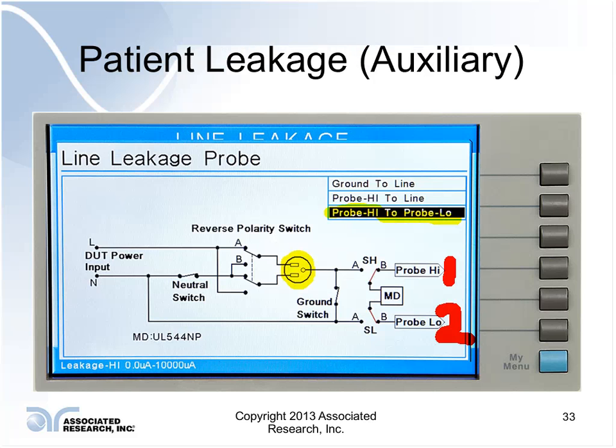back to probe low. Think about this as pretty much, I mean, anybody out there who's used a standard voltmeter or LCR meter or current meter or something like that, you're just using 2 probing points. It's almost the same thing. You just picture it as 2 probing points, and you're just going between these 2 points and measuring leakage current. It would be no different than measuring voltage with a voltmeter between 2 points, except this time we're measuring leakage current.